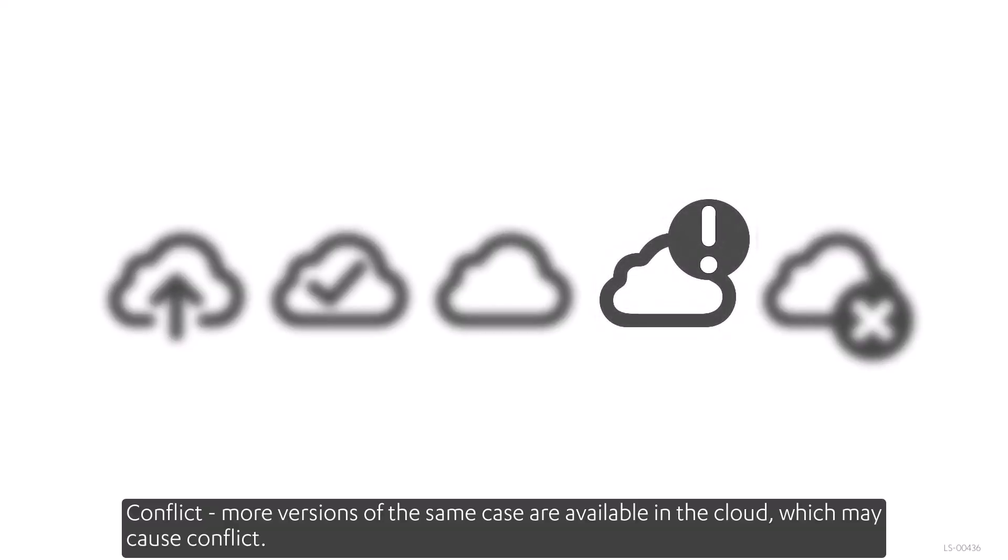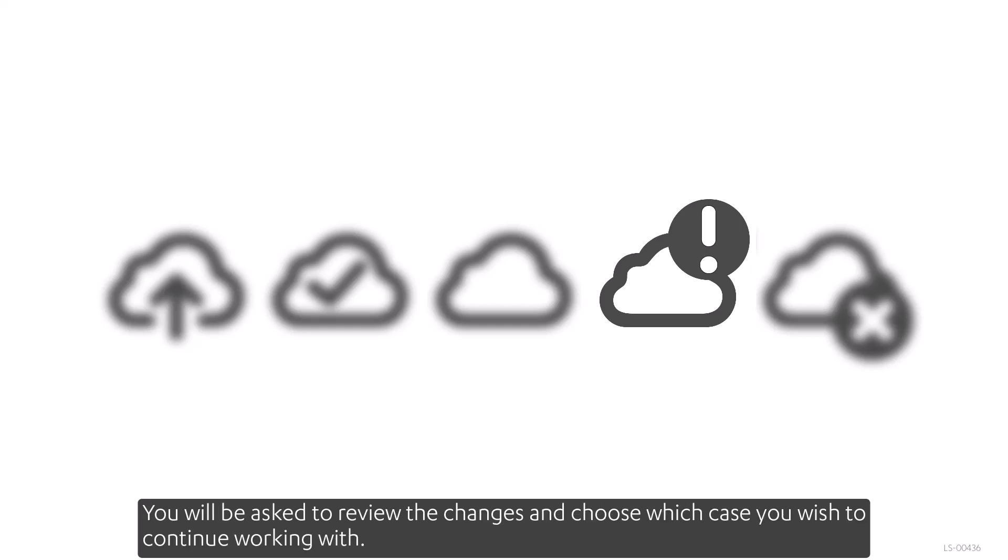Conflict. More versions of the same case are available in the cloud, which may cause conflict. You'll be asked to review the changes and choose which case you wish to continue working with.